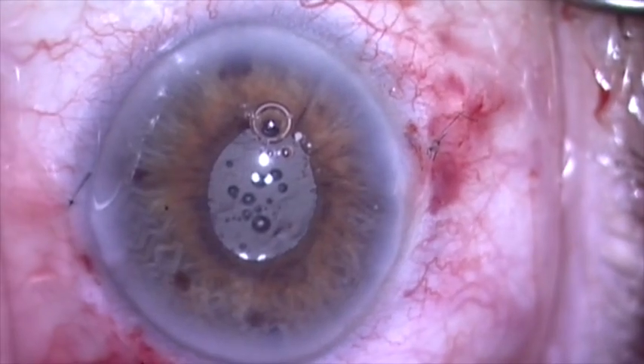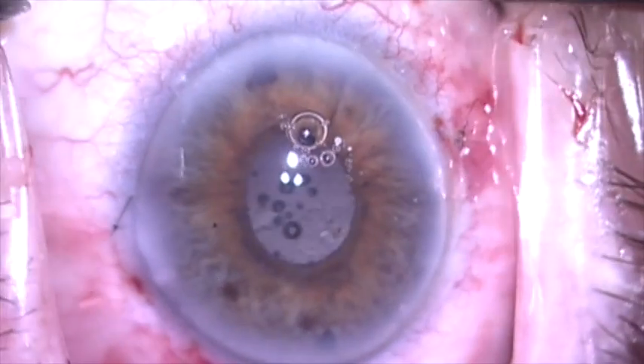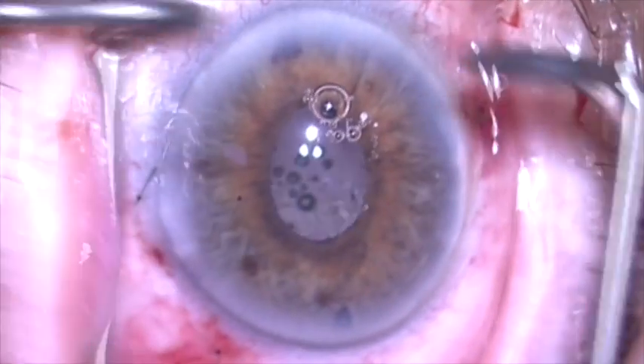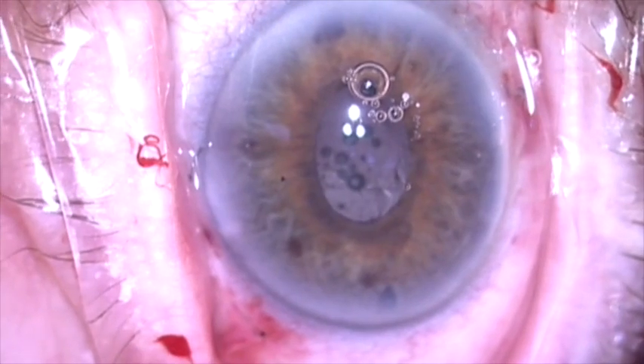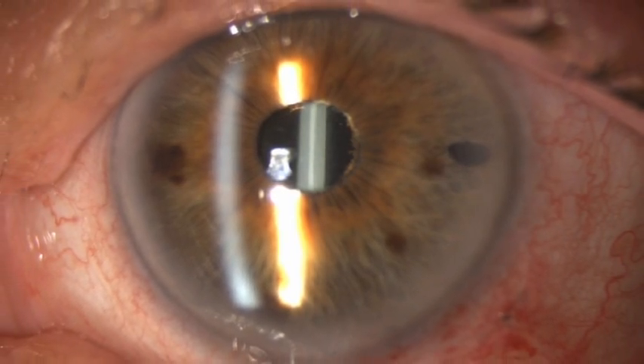This is what the patient looked like the next day at the slit lamp. The lens was very stable and centered, and the patient was 20/25 uncorrected and very happy with the outcome. Thank you for your attention.